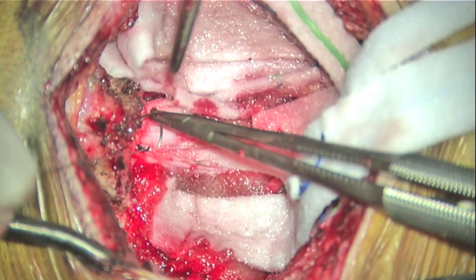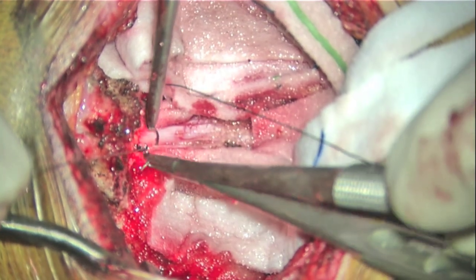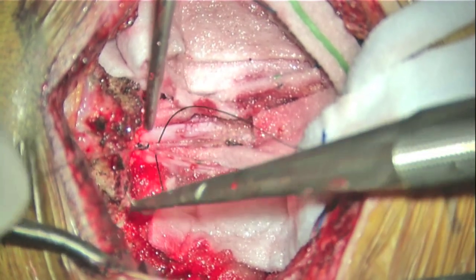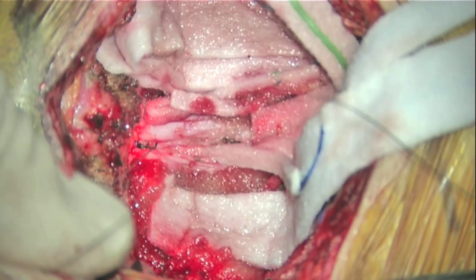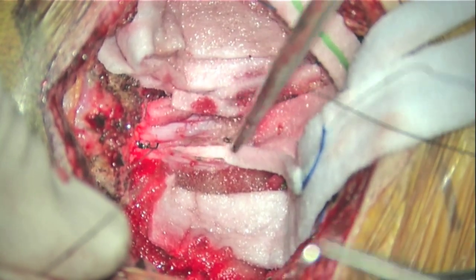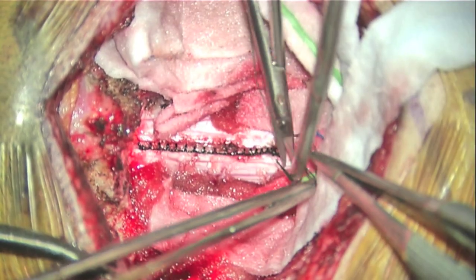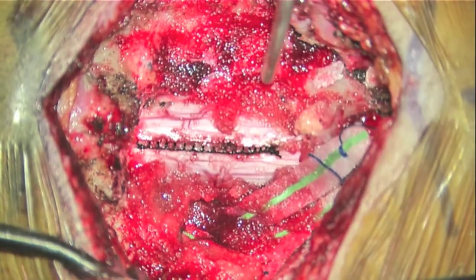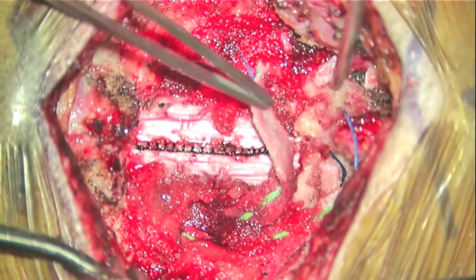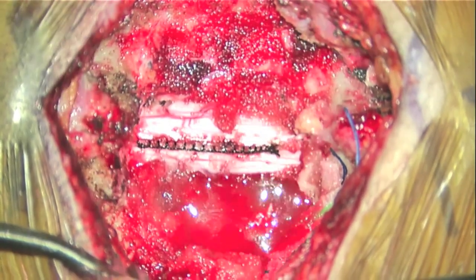The midline dura is closed with a running locked 4-0 silk suture. I Valsalva to 45 millimeters of mercury to ensure a watertight closure, then cover the suture line with DuraGen followed by a thin layer of gel foam. Foraminal and paraspinal hemostasis is carefully achieved with FlowSeal and gel foam.